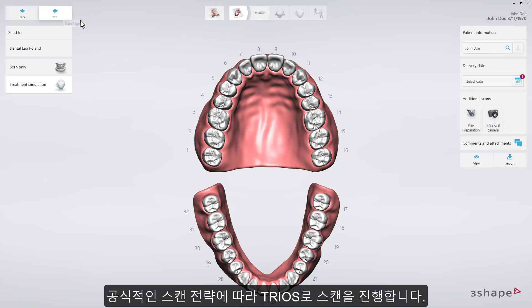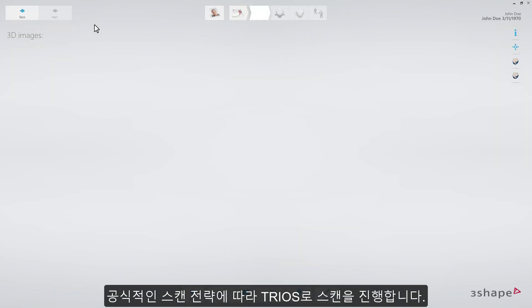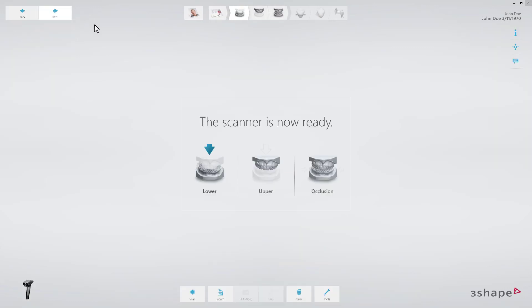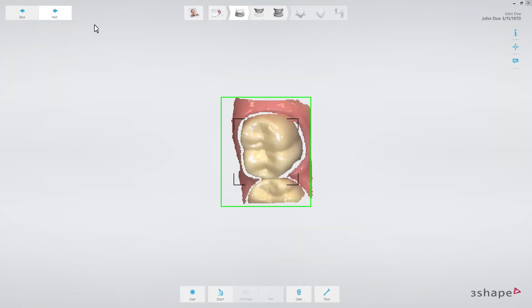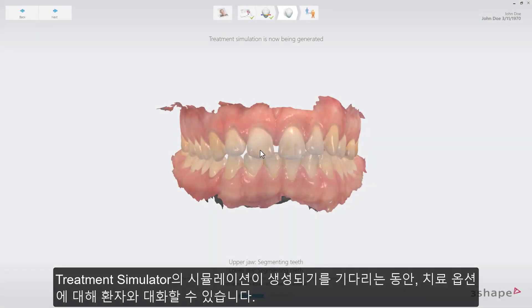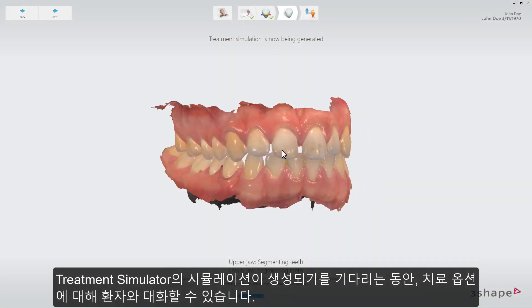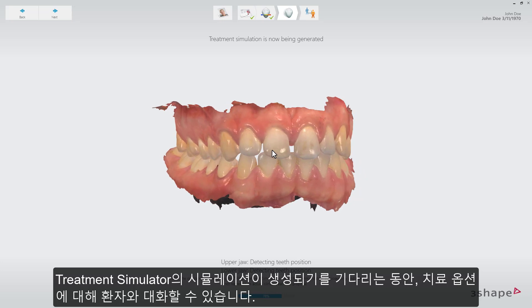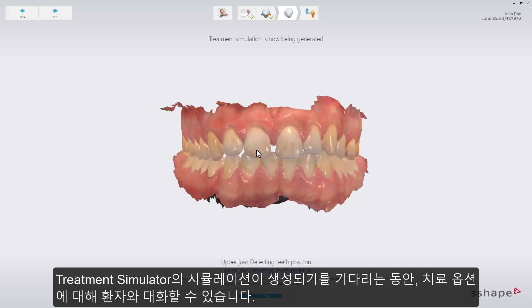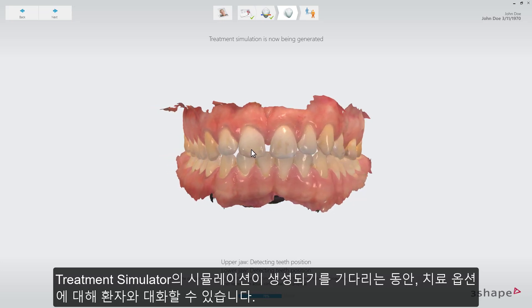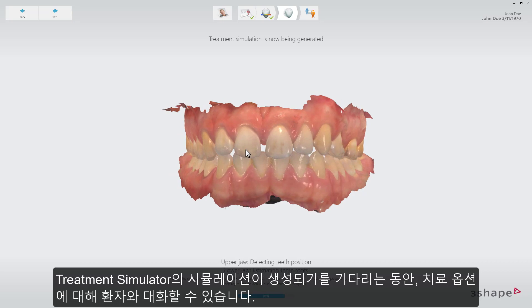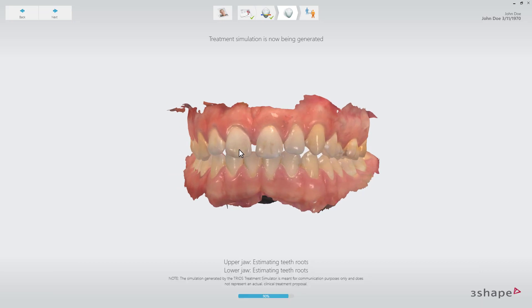Proceed with the TRIOSCAN according to the recommended scan strategy. While the treatment simulator is loading, it is possible to interact with the scan so that you can engage the patient in conversation — for example, about treatment options while waiting for the simulation to be generated.